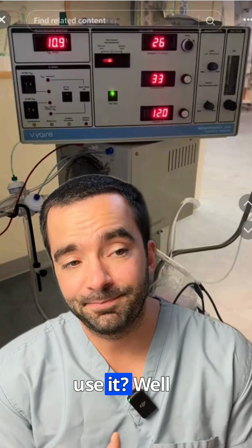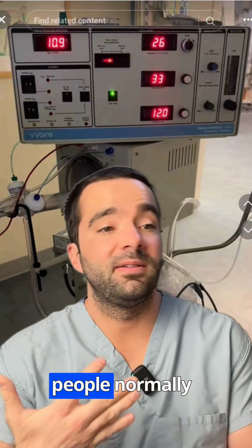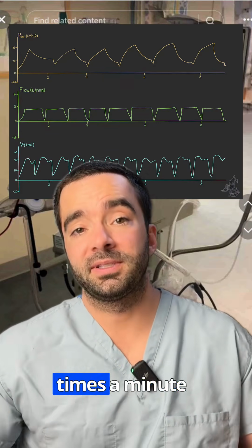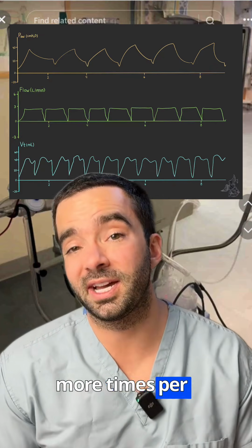Why would you use it? Well, normally when we put a breathing tube in for a patient and use the ventilator, we inflate the lungs the way that people normally breathe when they don't have a breathing tube in. So we take breaths a couple times a minute. And for babies, they breathe pretty fast. So we'll give breaths, 20, 30 or more times per minute.